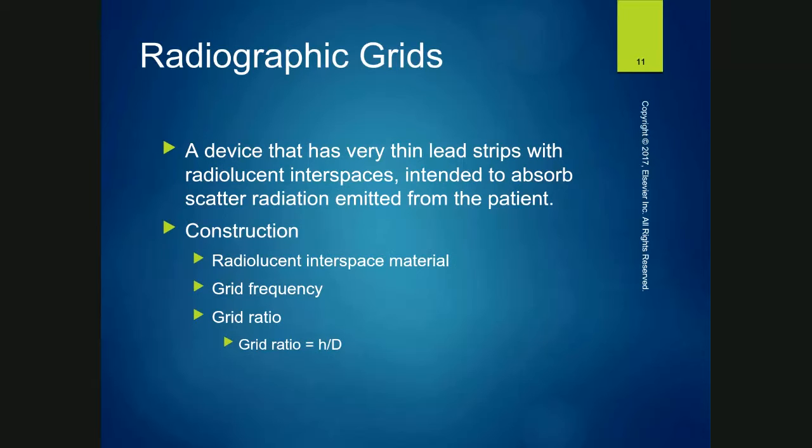It's a ratio of the height of the grid lead strips divided by the distance of the interface material between those lead strips. So it's a relationship. It's a ratio, just like I said. It's the height compared to the distance between them.